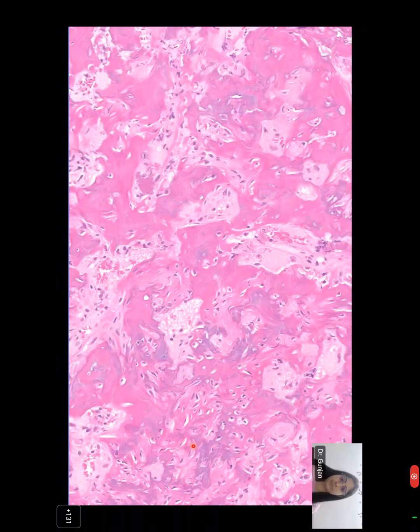We have radiology helping us because it looks very banal. We have that classical history that's helping us. So this cannot be one of those normalized, very sclerotic osteosarcomas. So I agree with your diagnosis. This is a fairly typical osteoid osteoma.